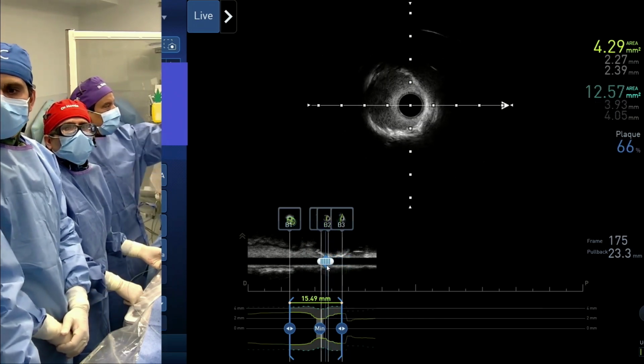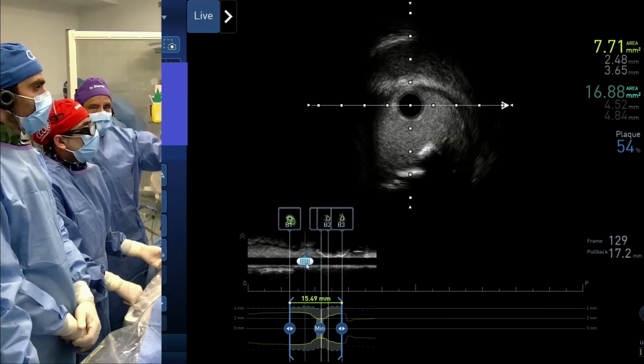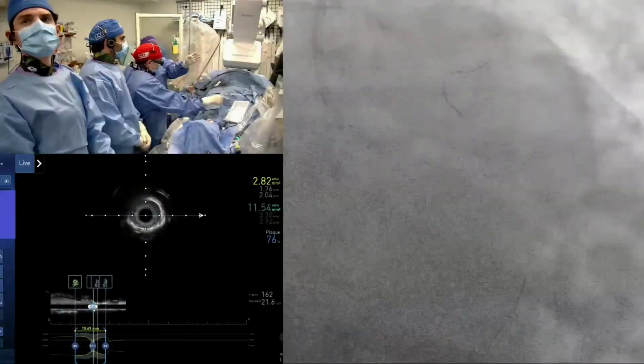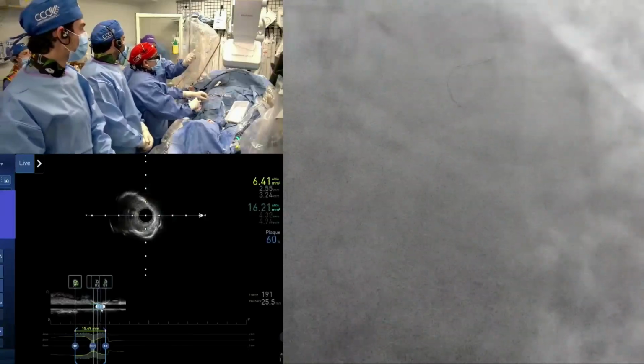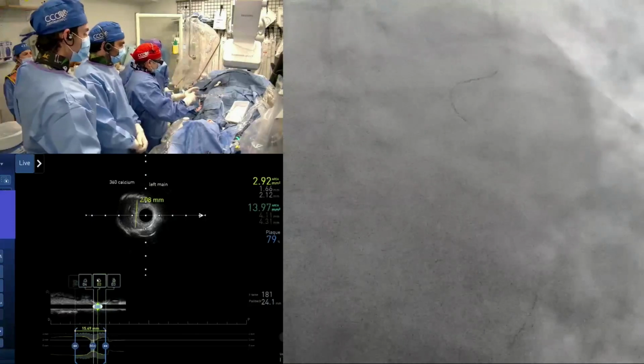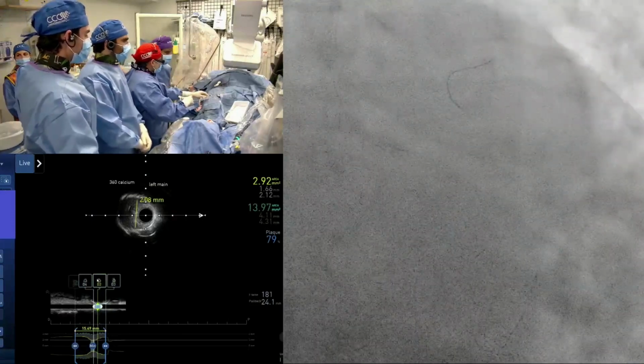All right, so that's where we are now. We want to take a picture now. The question is, and I know there is a good talk on the atherectomy, on the IVL. Here we have done the atherectomy, we have done the scoring balloon. I think this is a case we want to hear from the panel, but I'm ready to do the IVL.